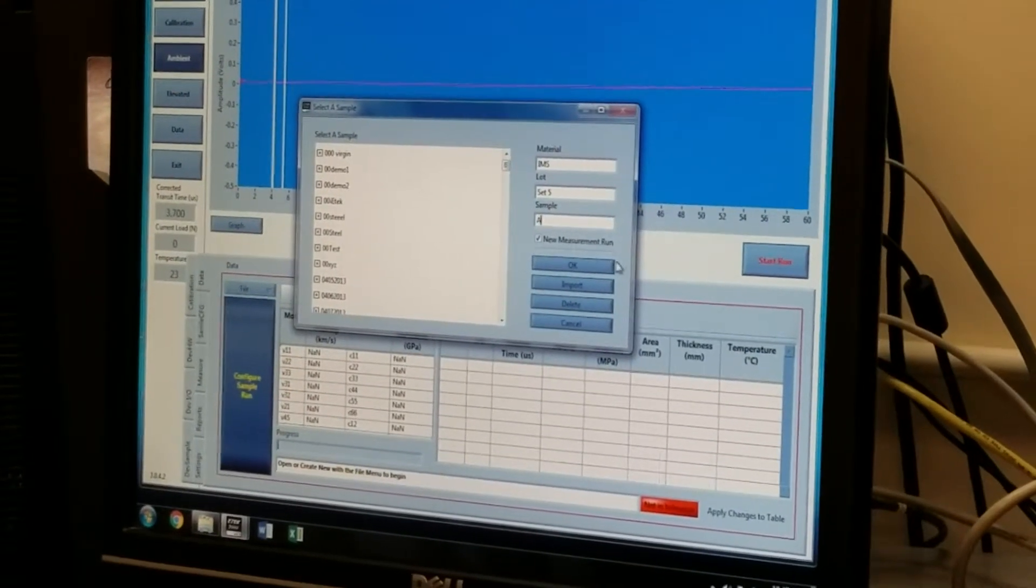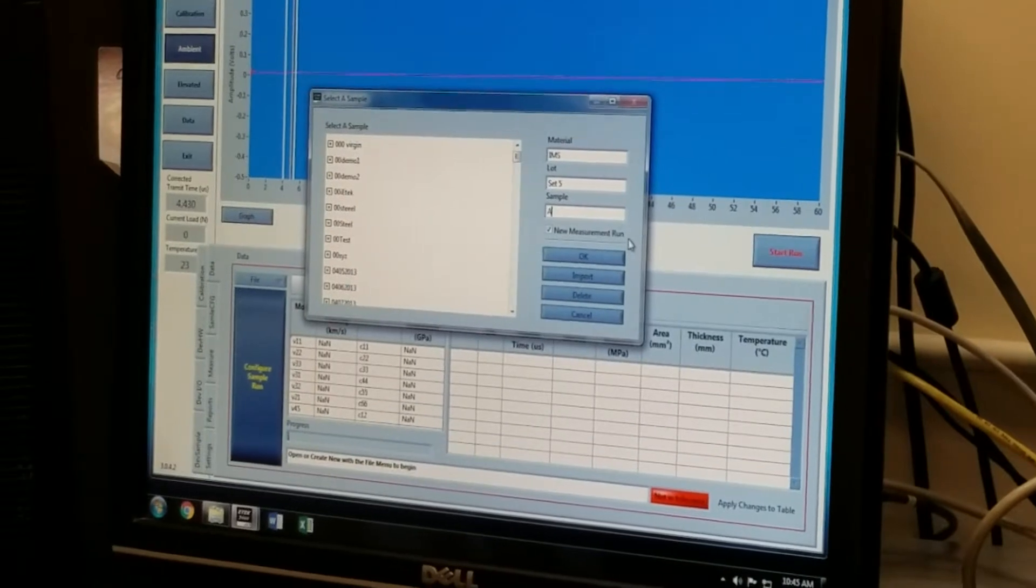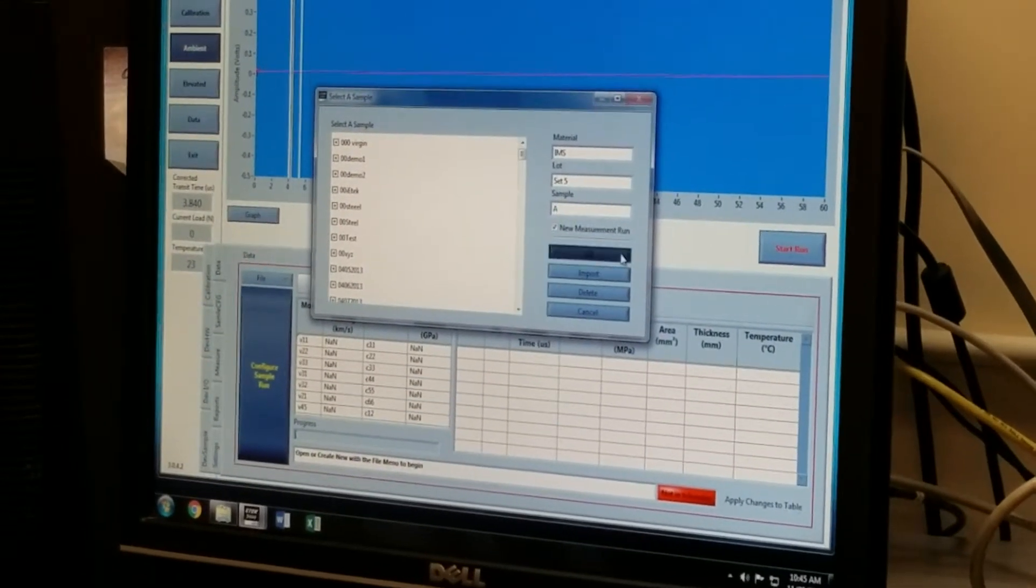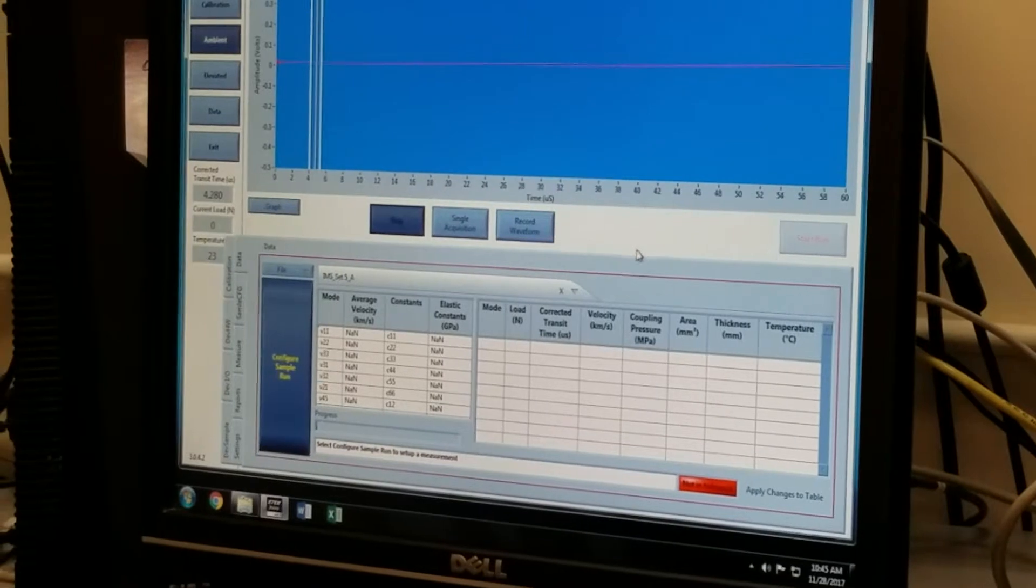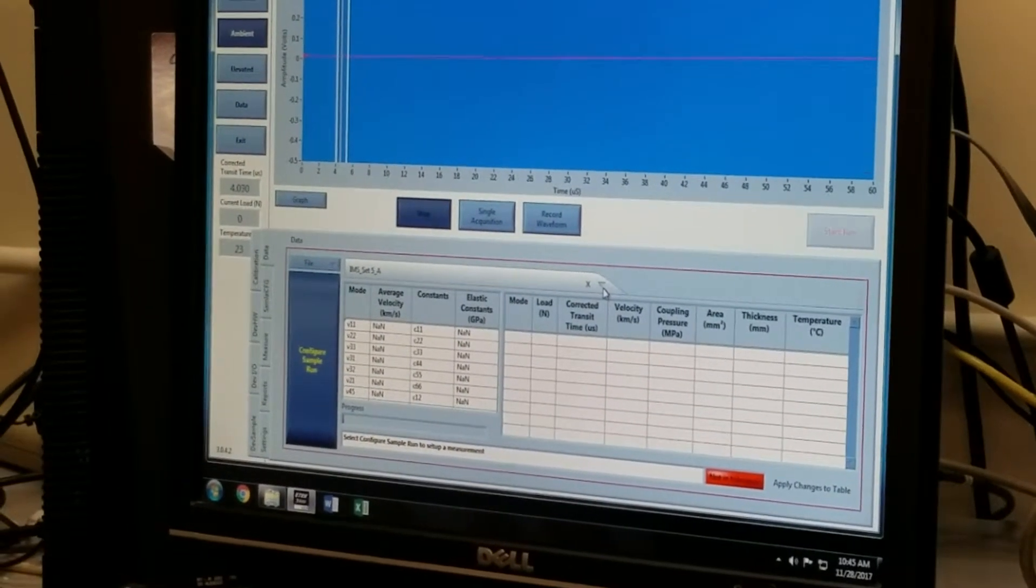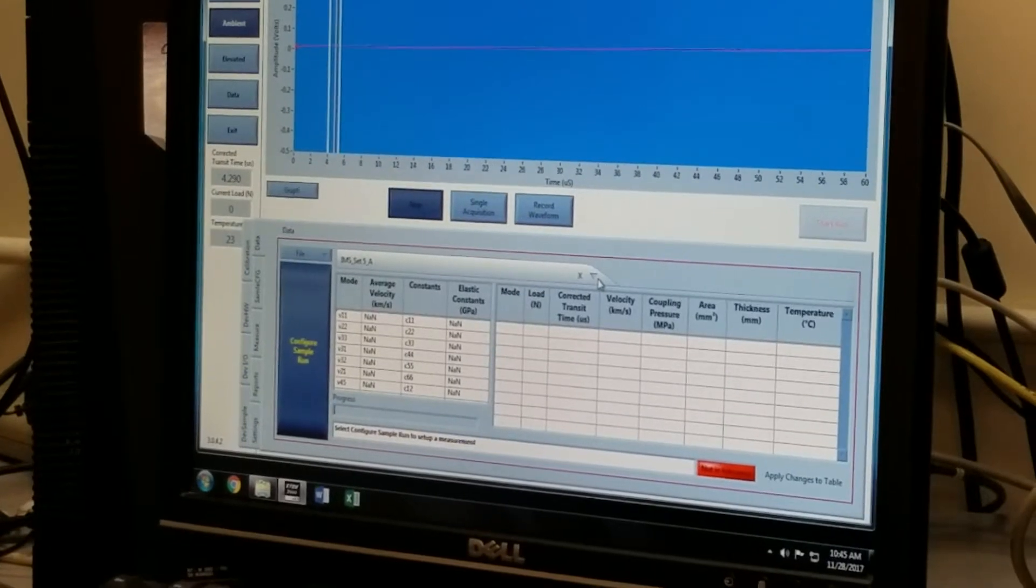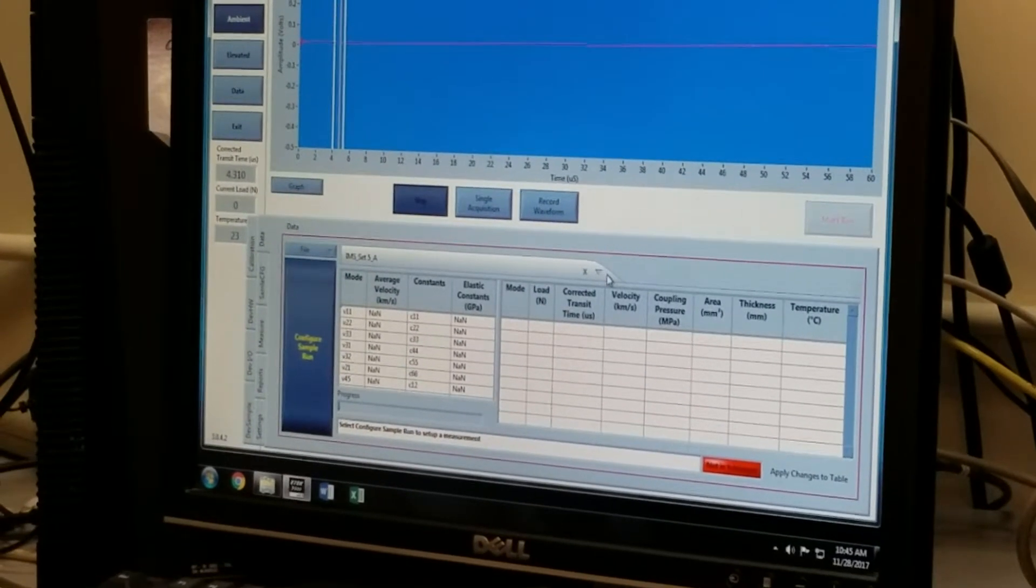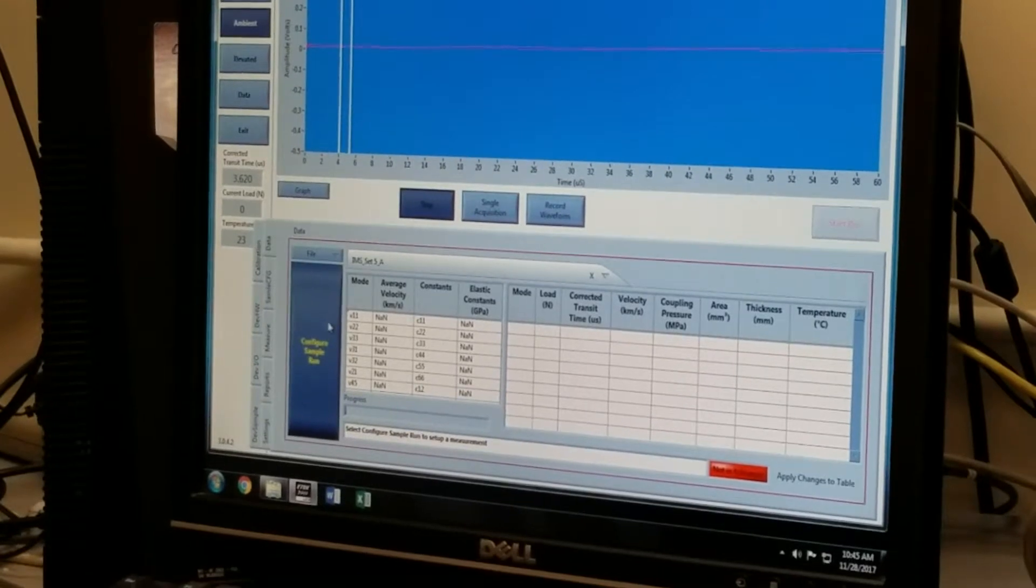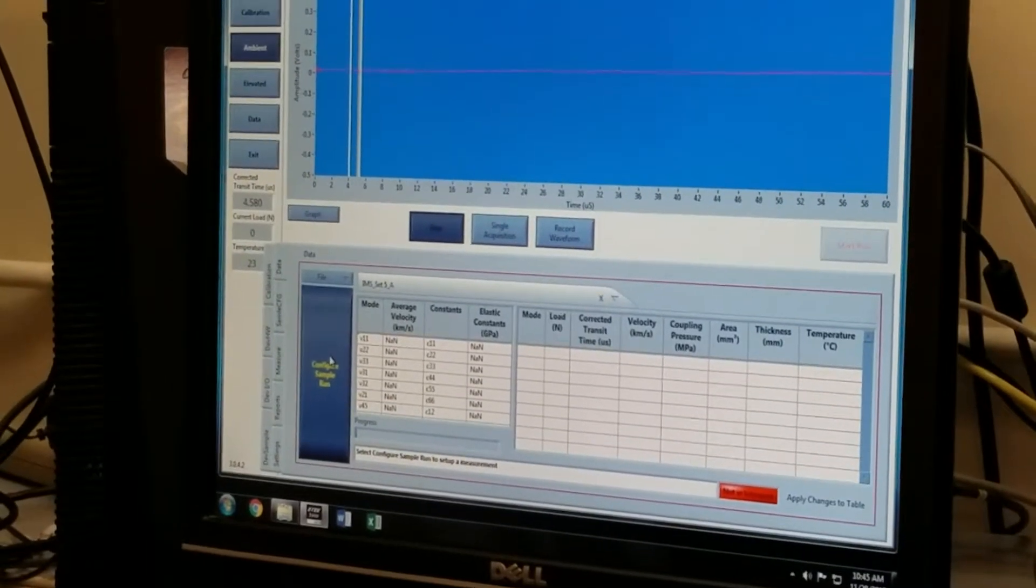The new measurement run is clicked because I have not measured these samples before, and now I'm going to press OK. At this point, I essentially will repeat for the B and C sample, but for demonstration purposes, I'm going to continue on with sample A.